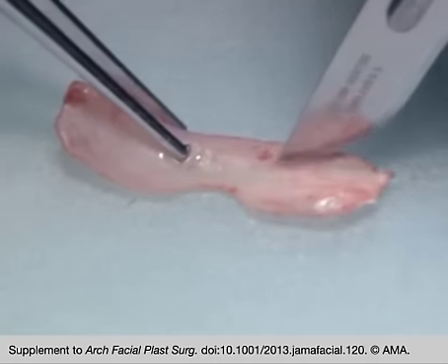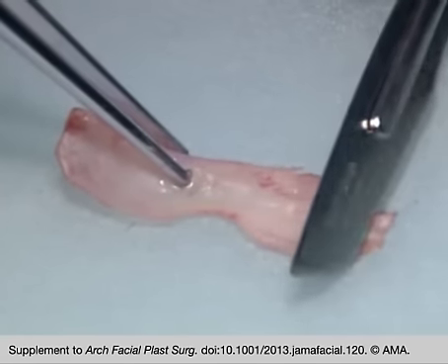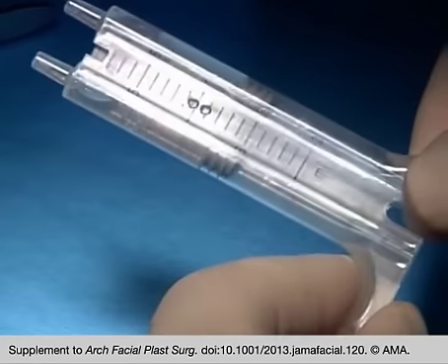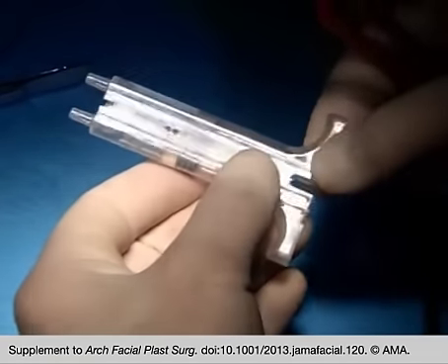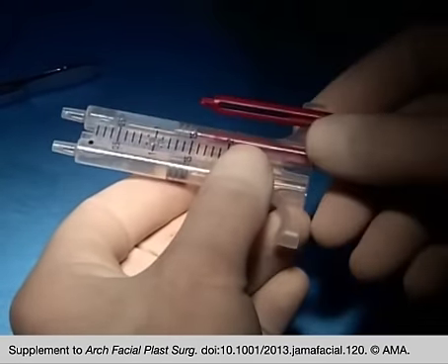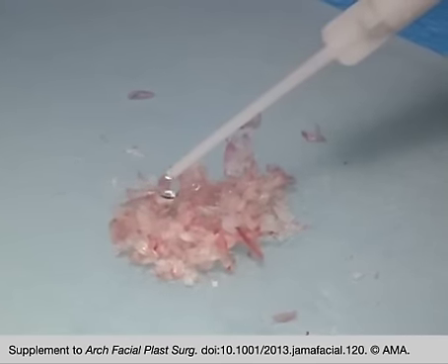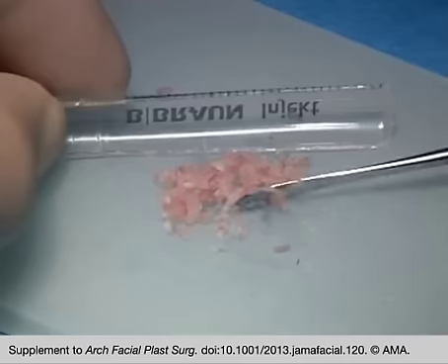Septal, auricular or costal cartilage is cut to fine dices or slivers. The thrombin component of two-component fibrin glue is used to activate the cartilage. A few drops are added to the cartilage and excess fluid is allowed to disperse on the frosted glass plate.